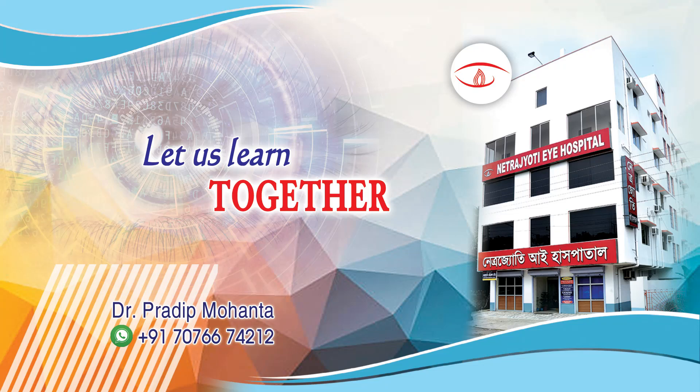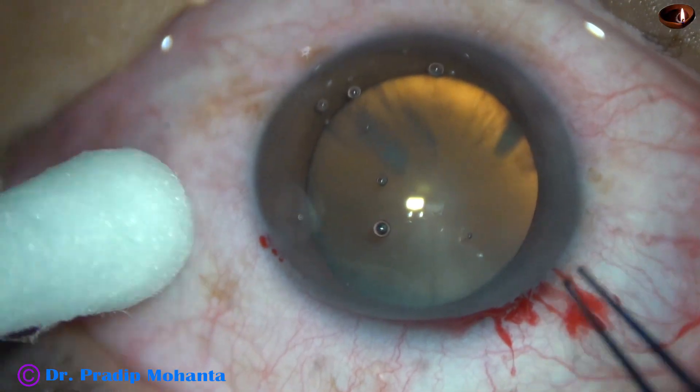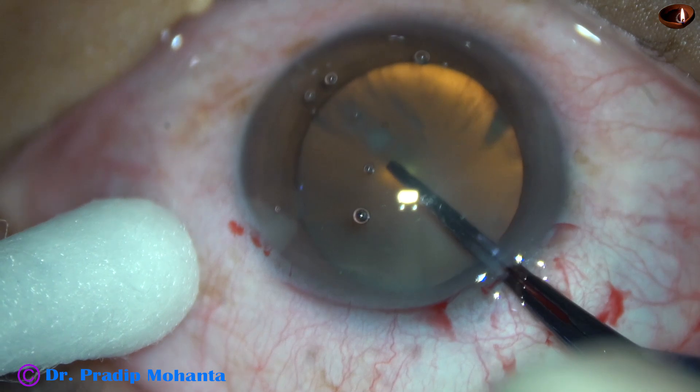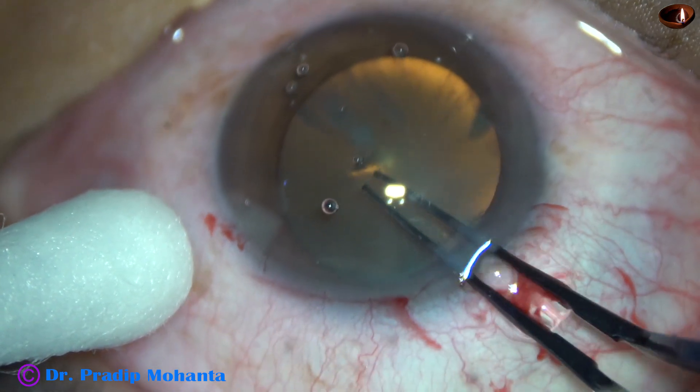Friends, welcome to my workplace at Ranaq Heart, West Bengal, India. In this video, we are going to see four cases of pre-chopper-assisted nucleus management. This is the first case.